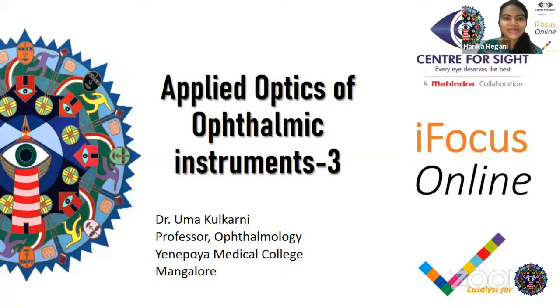Thank you. There are two questions on the slit lamp, ma'am. The first one is, how is angle alpha created in the slit lamp? Is it the same as what is present between the eyepieces? No. Angle alpha has to do with the objective side of the slit lamp. So IPD is on the side of the examiner. If I'm seeing your eye, the IPD is on my side, and on your side is the angle alpha. It is mainly because of the objective. The objective is located wide enough and at such a distance that the beam of light passing through the objective lens offers the angle which is required for a good stereopsis. So I have tried to explain. I'm not sure whether it was clear.